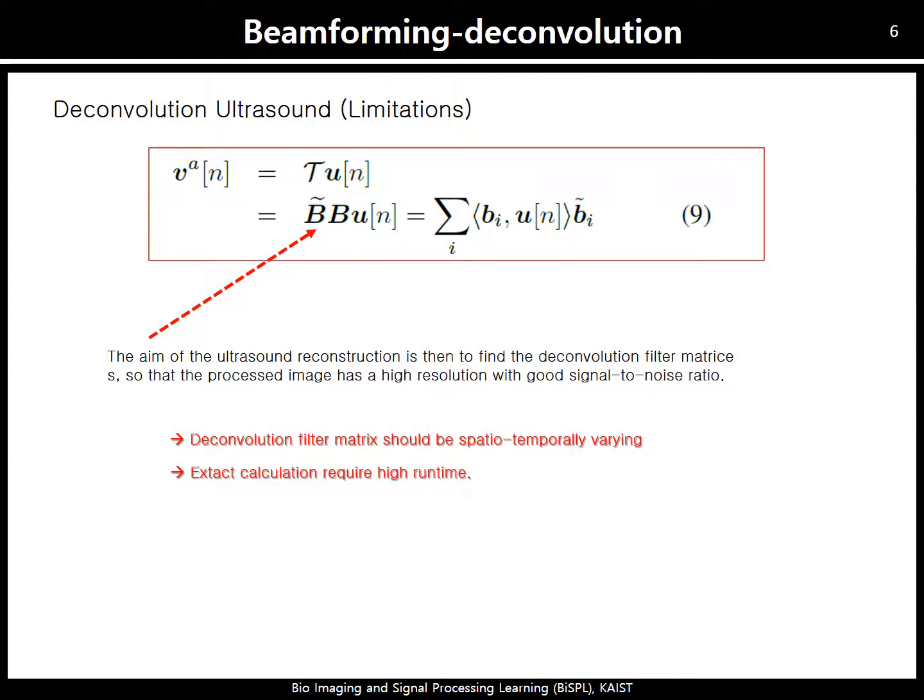A quick remedy to reduce this runtime computational complexity would be pre-calculating the nonlinearity in tau. Unfortunately, as stated before, the mapping depends on the input signal, so it requires huge memory to store tau for all input patterns, or at least most of the input patterns, because it's a combinatorial problem, and there are tons of possibilities; your signal can vary in various ways.